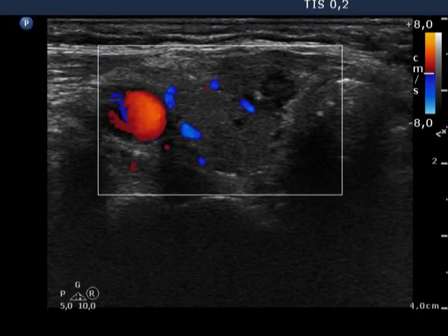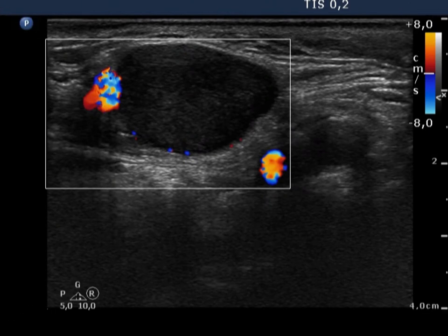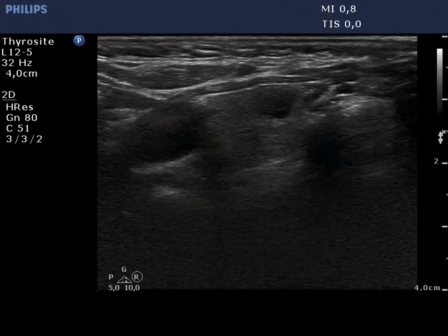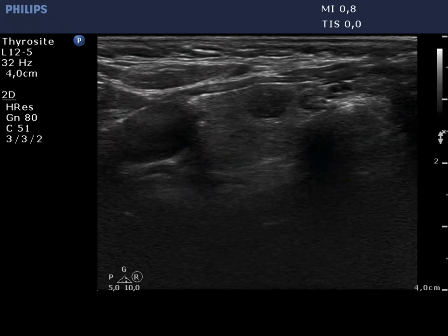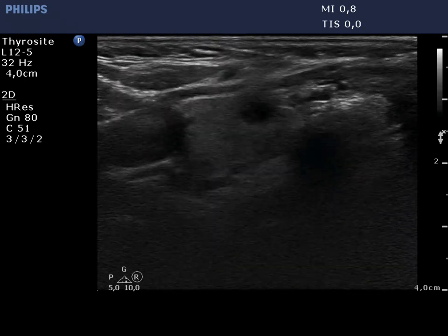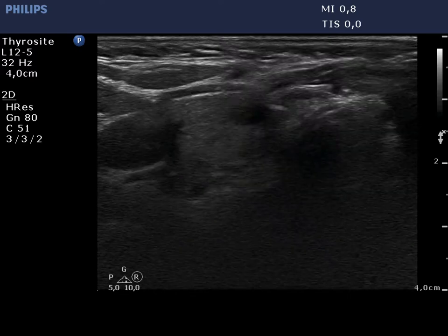The vascularization of the thyroid nodule is not specific, while the lymph node displays no circulation on Doppler mode. Finally, an ultrasound-guided aspiration from the thyroid nodule is presented.